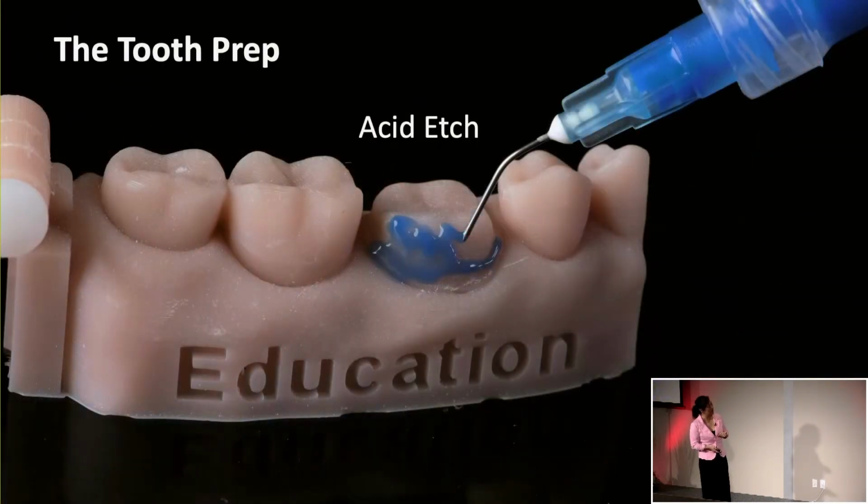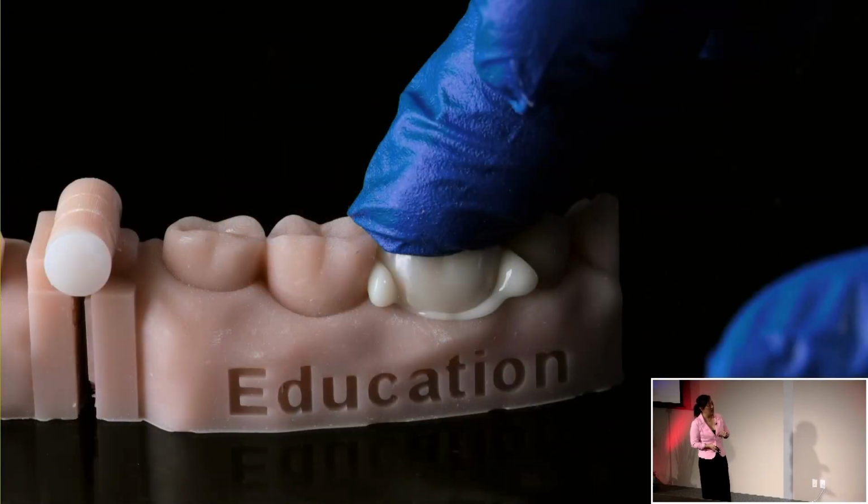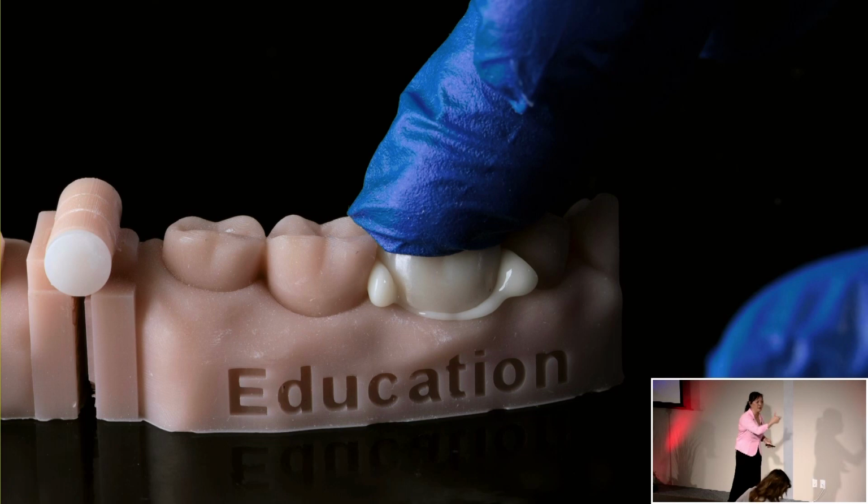So here's the cement, acid etch, adhesive, and then we're going to plop that restoration on top. We want to see the cement squish. If you don't see it, that's a problem. You want to tack cure. Now, everyone's light cure is a little bit different. The setting might be stronger or less unless you've calibrated. So I caution you when you tack cure, don't go the full 2 seconds that they recommend. I would just do a blip and then check it, because if you over cure the restoration, you're going to have a tough time removing it.